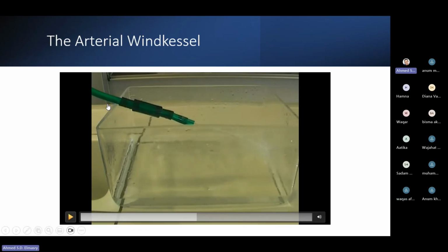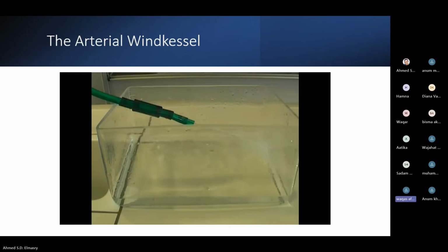What you see here, can you explain what you are seeing during the systole and during the diastole? Actually, the video is not running smoothly, so it is difficult. Okay, just from the sound, you can hear that during the contraction of the heart, the blood is going to the circulation during the systole, right?